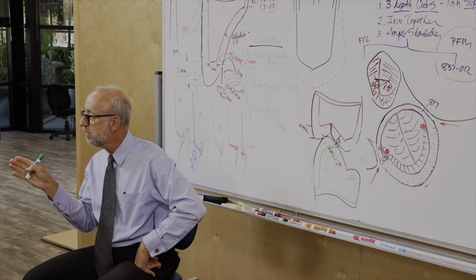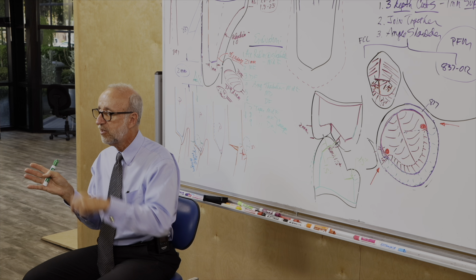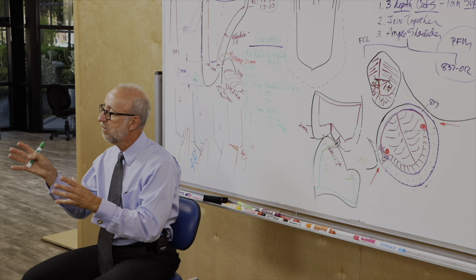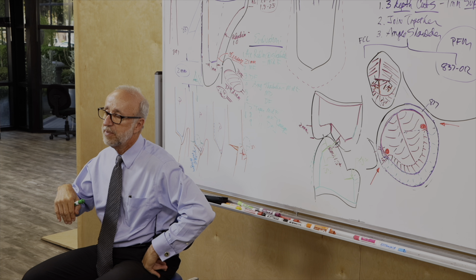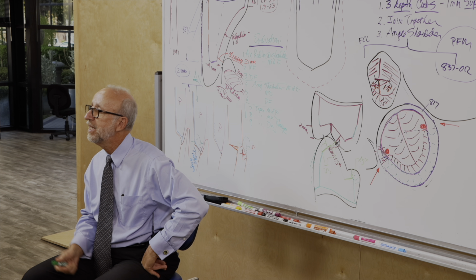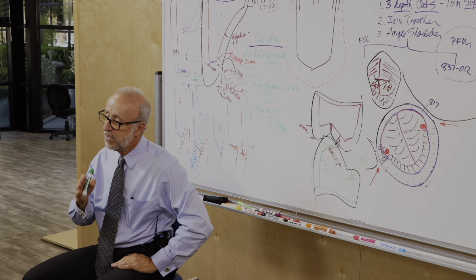If you're way out here, the only way to keep that restoration, if it's an amalgam restoration, firmly within the prep may be to put a pin on the gingival floor. Okay? To create some other kind of retention so that extra amalgam out there can be retained the way it should be. If failing putting the pin in, then we have a prep that probably will fail prematurely, and that will be a failing error. So it's all a matter of degree. Any error that we do can be a failing error, can be a major error by shortening the lifetime, but it depends on how much it is.